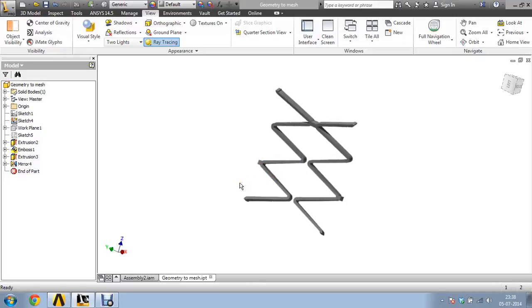Okay, so today we'll see what computational design and analysis can be done on stents. Stents, as we know, are the mechanical components which are inserted into coronary arteries to prevent the plaque from collapsing the artery. So this is typically a one cell mirrored component.